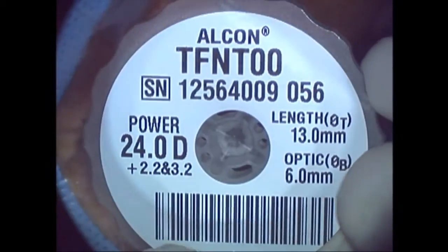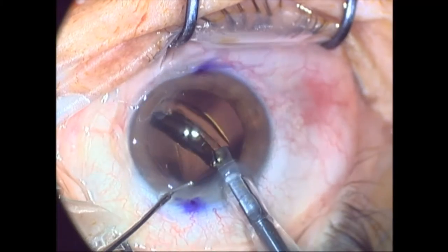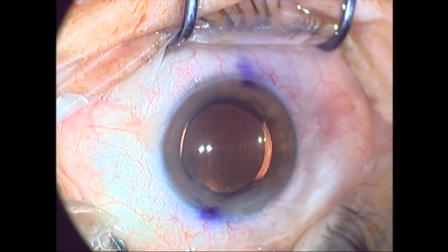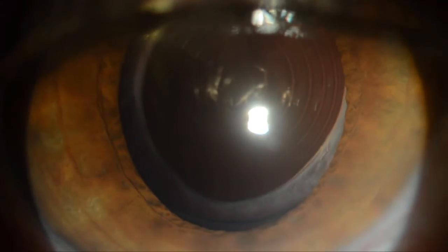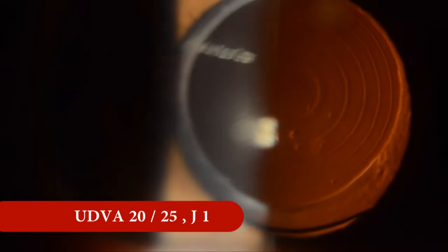The surgery was uneventful and a CTR was also implanted, as we routinely do for multifocal IOLs. Three months postoperative slit lamp examination, shown here, displays a perfectly centered IOL, and some degree of anterior capsular rim opacification. The patient was thrilled with her vision. Uncorrected distance visual acuity of 20/25, J1 for near, and spectacle independence.